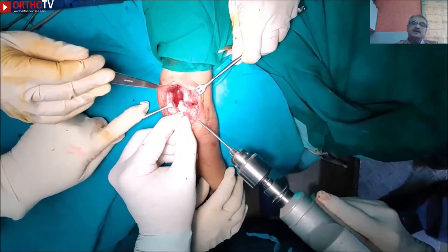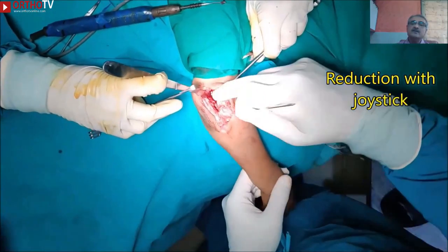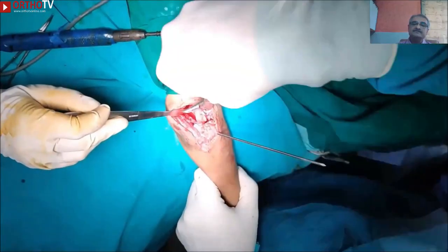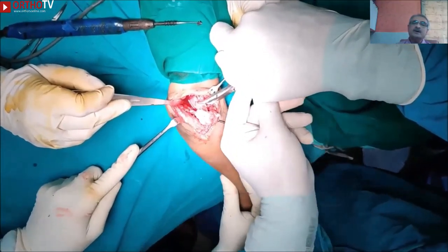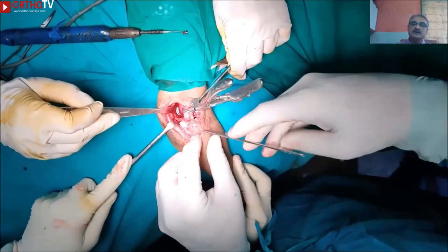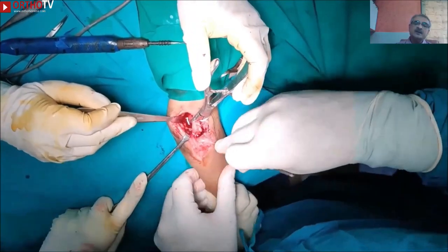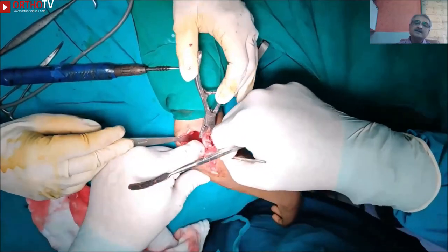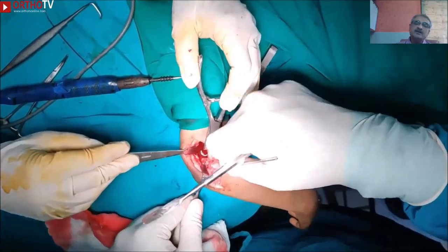Make sure the joystick comes just above the articular cartilage so that the same joystick can later be advanced to fix as a horizontal K-wire, which I will show a little later. If proximal fragment control is required, a wound clamp or a K-wire could be used as a joystick. Having control of both segments, the intraarticular part of the fracture should be aligned using the joystick. It is advisable to spend maximum time to get good intraarticular alignment.